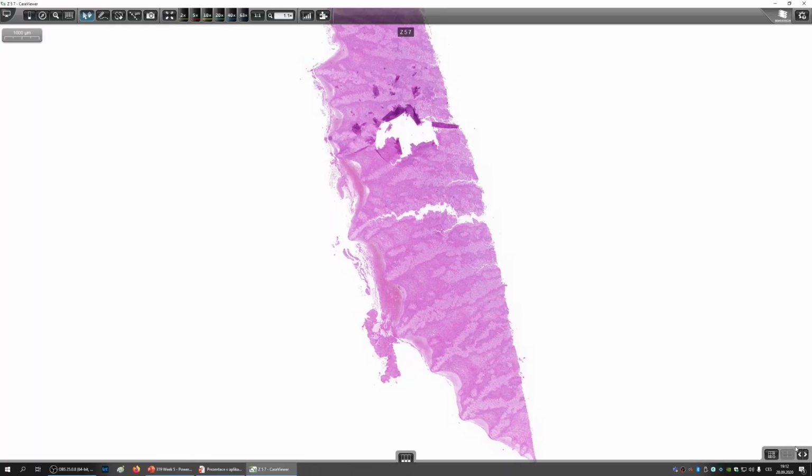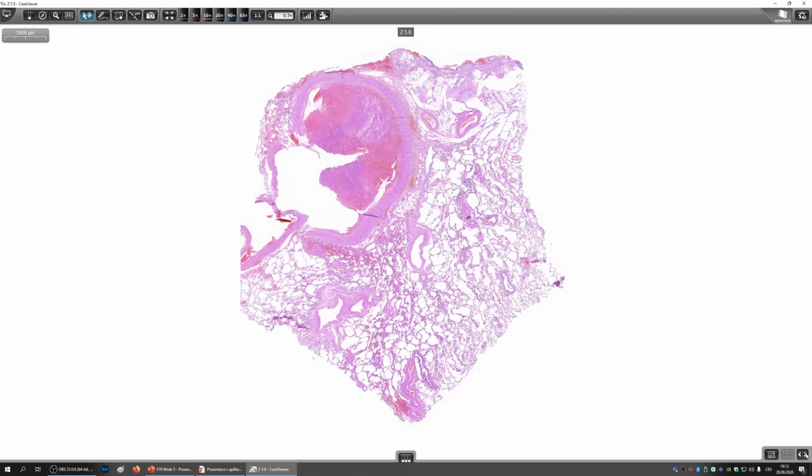So let's have a look at the slide. Remember the theory, this is extremely important for your future as a doctor, if you want your future to be outside of the prison and courts.